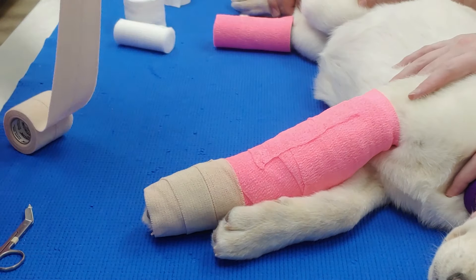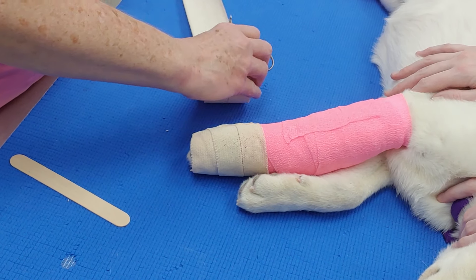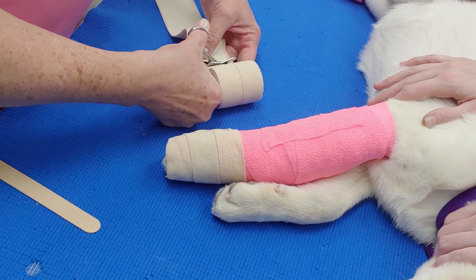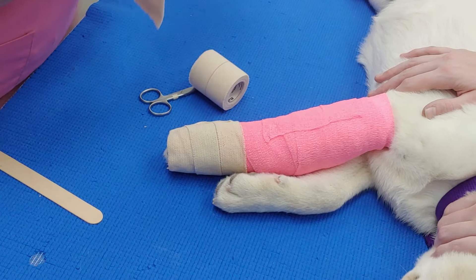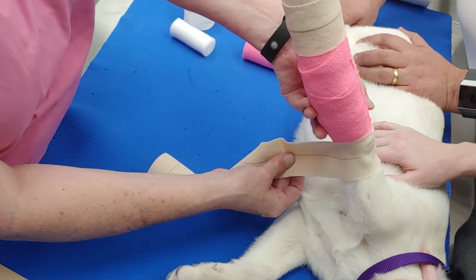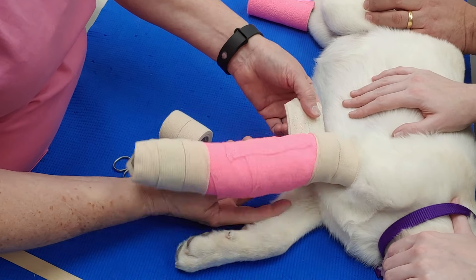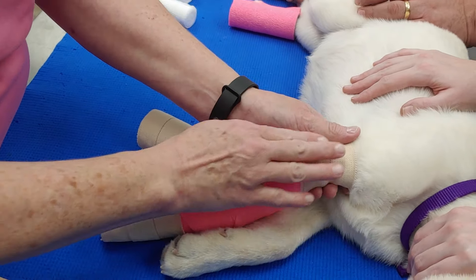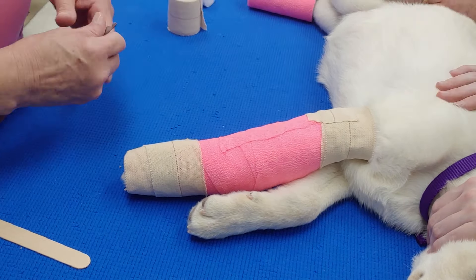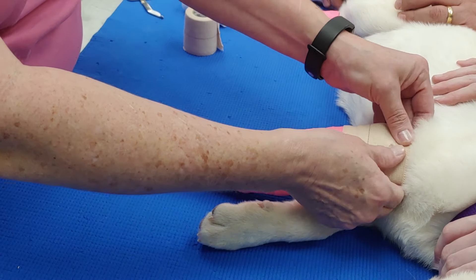This one goes on the top and I'll put it over top of the fur so that it anchors it onto the body — just put it on halfway, over top and around. You should always apply a bandage to a dry limb or body part, because any moisture in there can cause a lot of dermatitis, infections, and skin infections. This leg was nice and dry — the owners have been doing a good job at keeping it nice and dry.